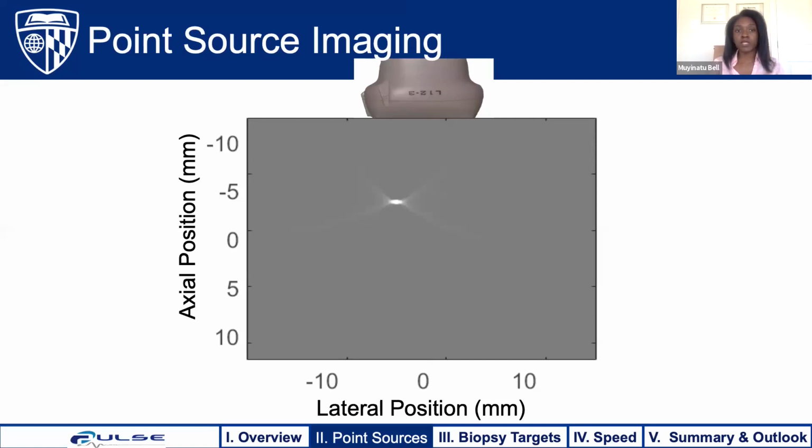For example, we assume that there's a constant speed of sound when in reality, speed of sound can vary among tissue and among different patients. Another assumption that we make that's not true is that there's a single pathway from the source to the receiver. But in reality, there could be reflectors such as bone that would reflect the traveling sound wave.